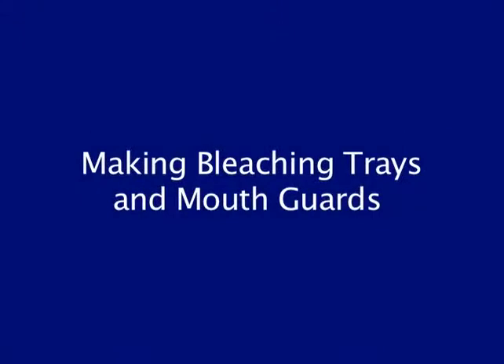To conclude this portion of our impression taking, we have covered the types of impression trays, how to care for them, what the differences are between the trays, how to handle an alginate, how to mix an alginate, and also stone and plaster handling as well.